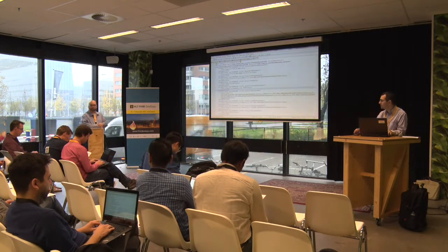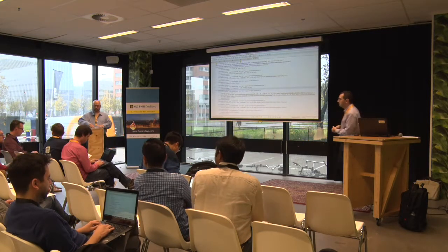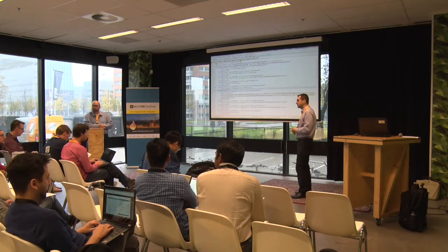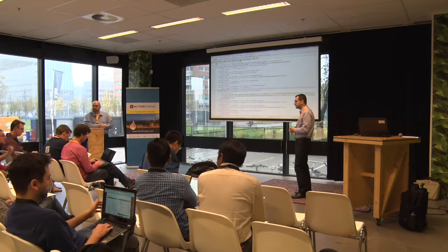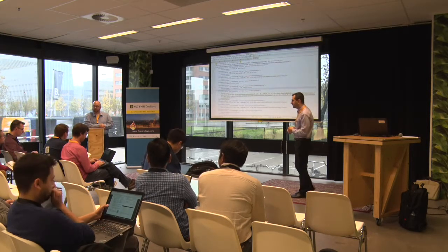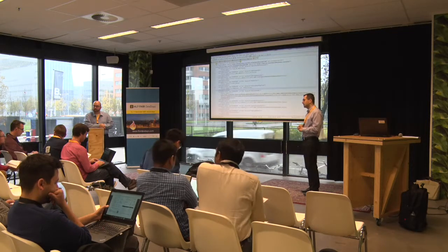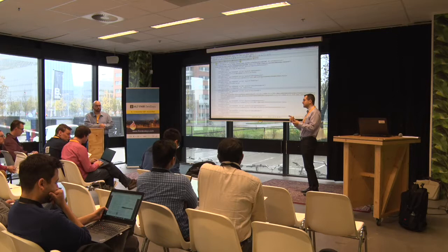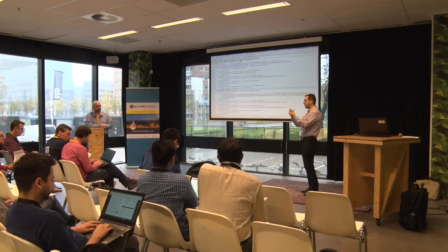Okay? Yeah, go ahead. Does it function in the same way as QIDO-RS, that if you provide more arguments in the request URL you get more of the tags available? Does that depend on the implementer, or is it a standard? No, there's a standard way to do it. It's called include fields. It's a magical parameter that you repeat for every field that you want to add. Ah, okay.